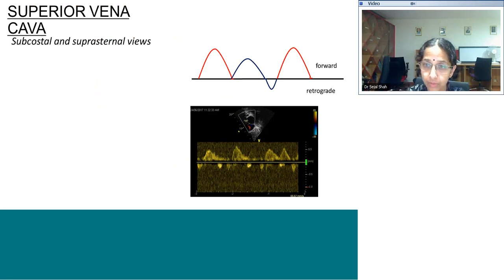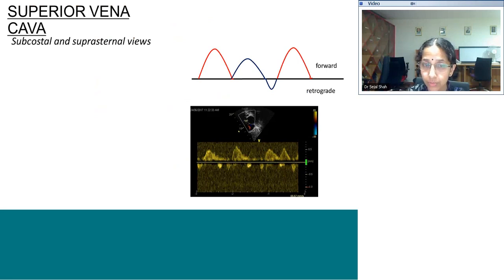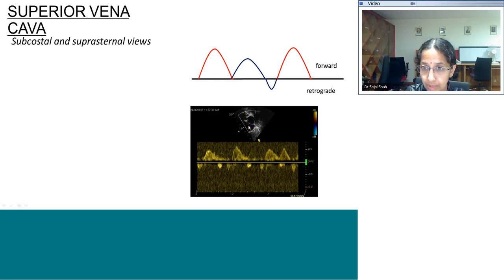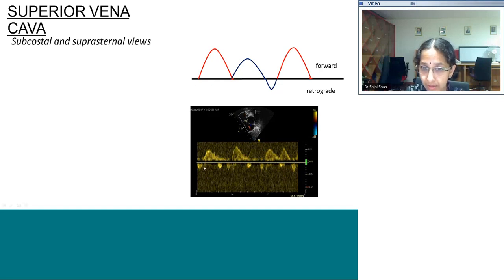The first Doppler we examine is the superior vena cava. We go systematically from the right heart to the left heart. The SVC can be seen from subcostal and suprasternal views. After getting the 2D picture, put color Doppler on before taking pulse or continuous wave Doppler. In the subcostal view, the red flow entering towards the probe is the SVC, so the Doppler pattern will be above the baseline. In the suprasternal view it will be below the baseline. The SVC Doppler has three waves: S, D, and A.